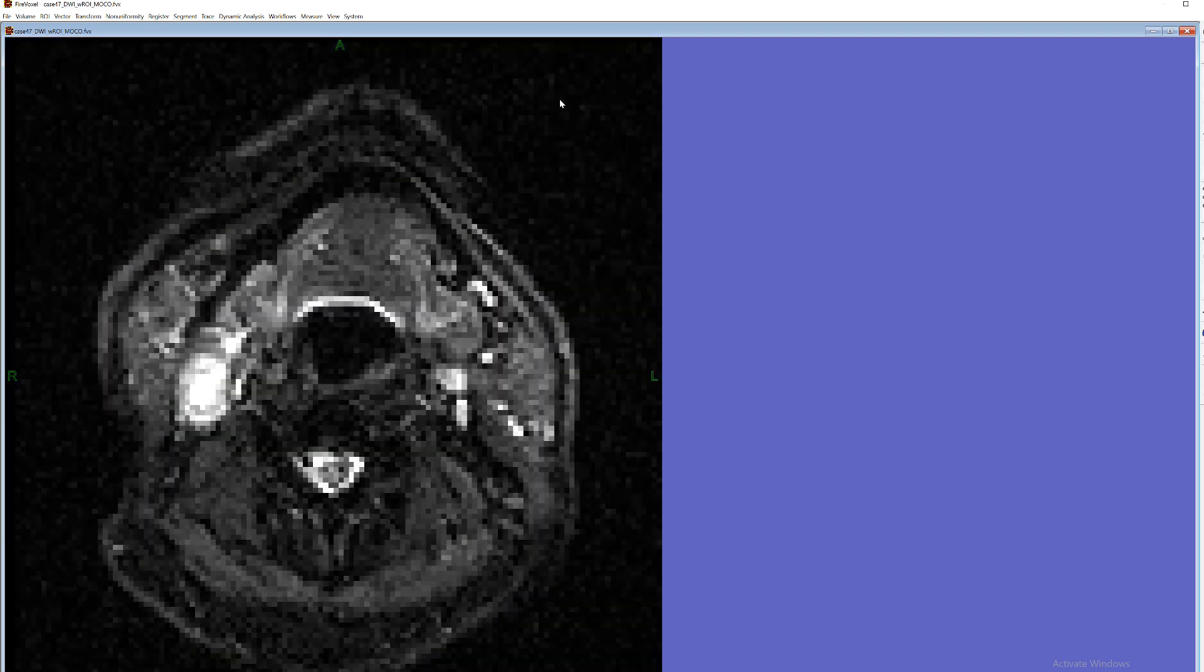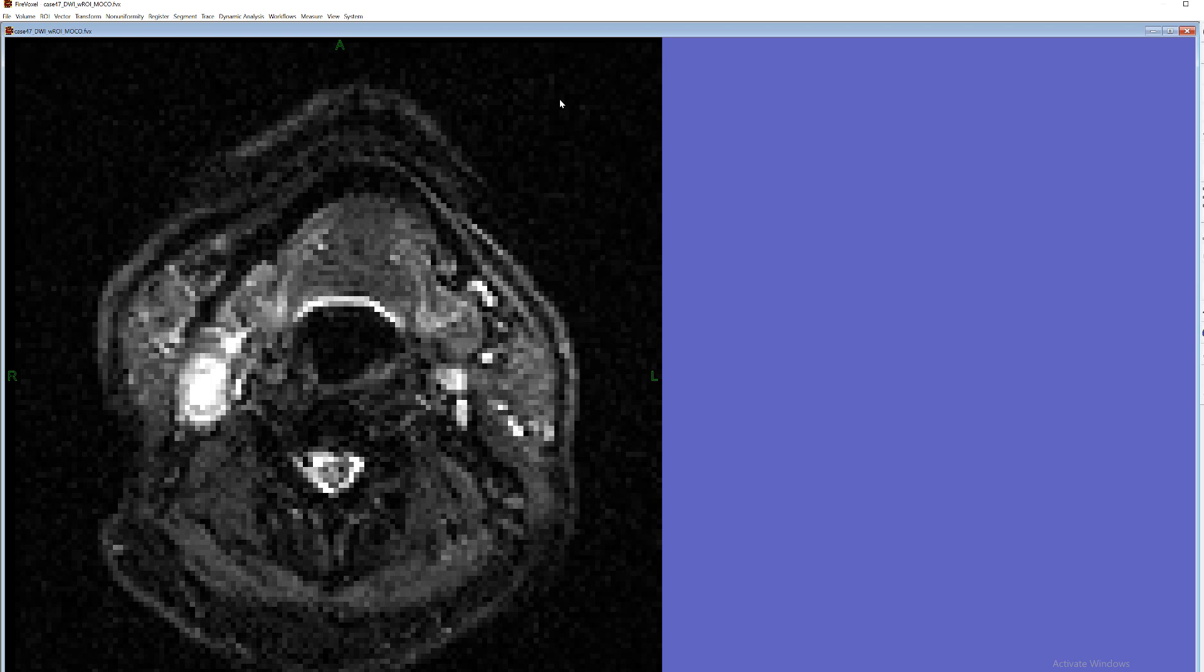However it might be helpful sometimes to have actual overlay of different time points so the displacement could be more easily detected. So there is this new feature.